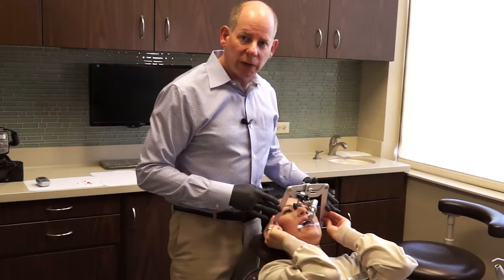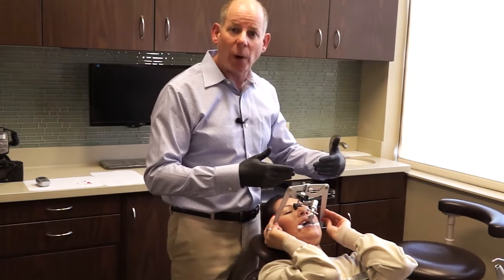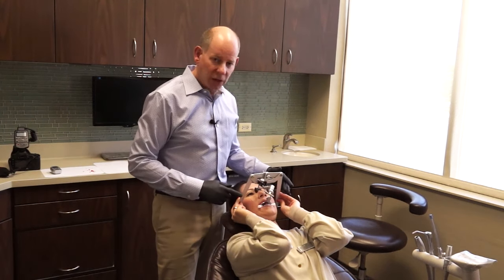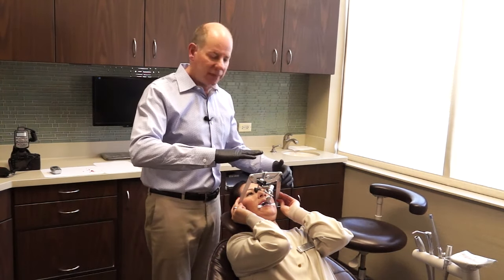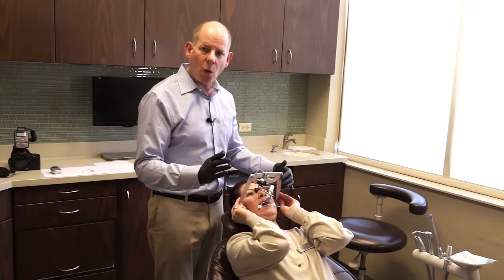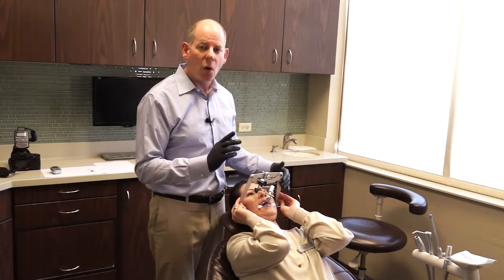Now the ear bow is connected onto the mounting plate but not tightened yet — I need to check that it's parallel to the horizon. Once it's in place I lock the mechanism in the center to keep the ear bow firm. You can do this one of two ways: lean the chair all the way back and use the floor as the horizon, then tighten the single mounting jig screw — or, as I prefer, seat the patient up, move them to the dental assistant stool, and do it while they're sitting upright.